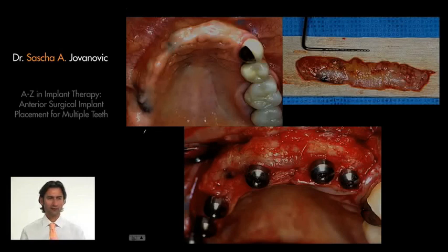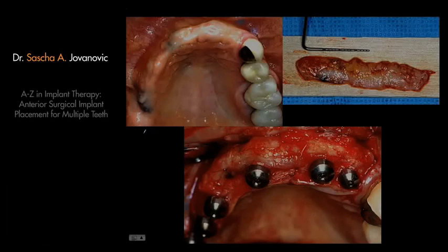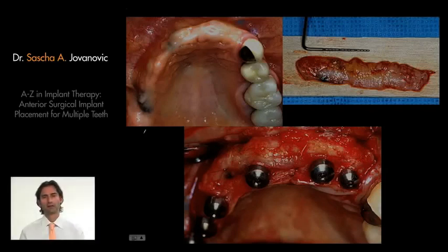And we're going to allow this uneventful healing to continue without the removable partial denture the patient wears as a temporary, for as long as the patient allows. Because pressure will always put some compromise on the healing. And soft reline, recontouring is necessary.